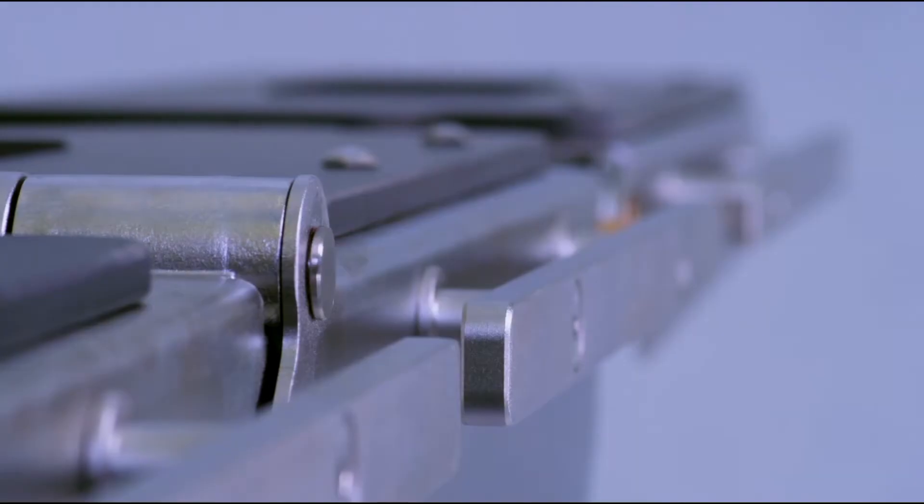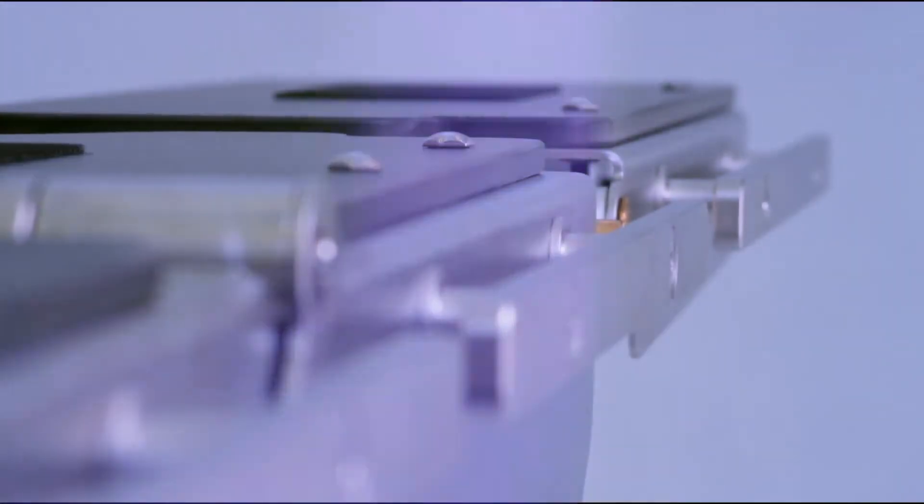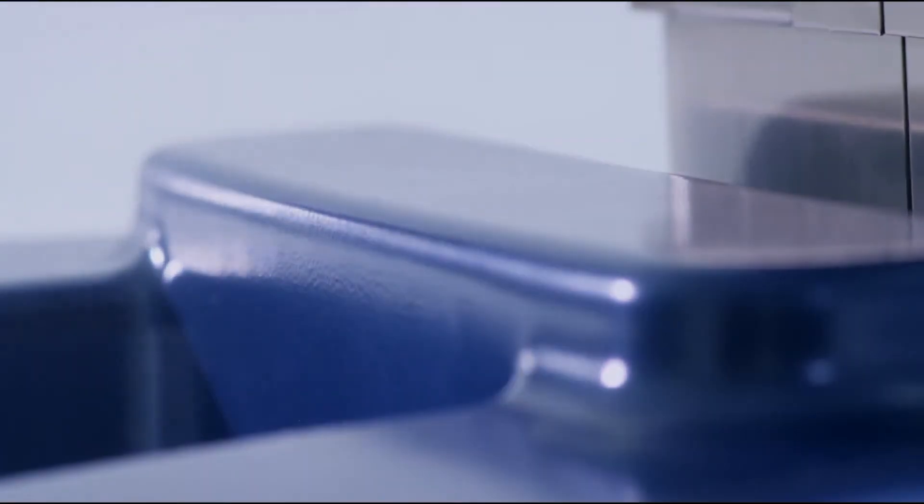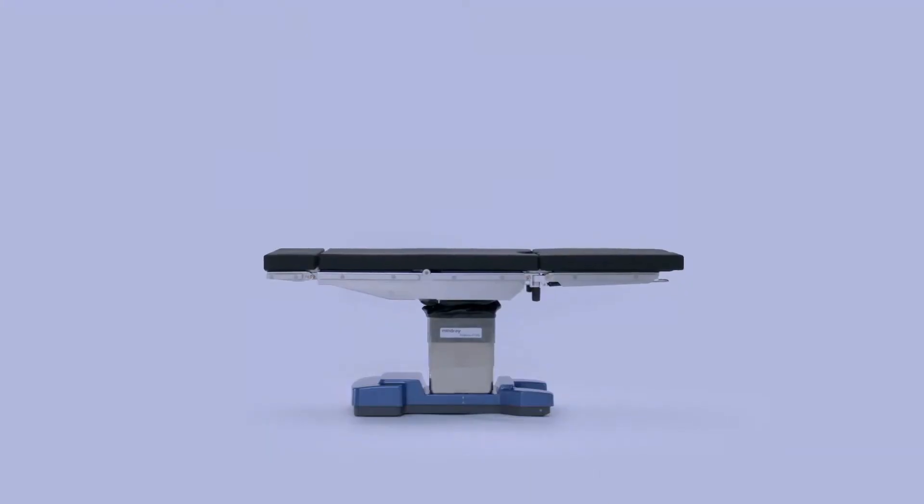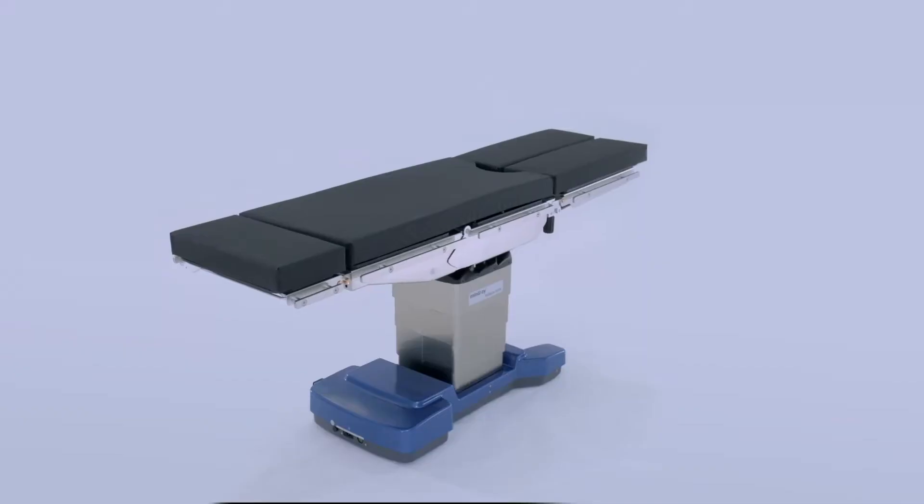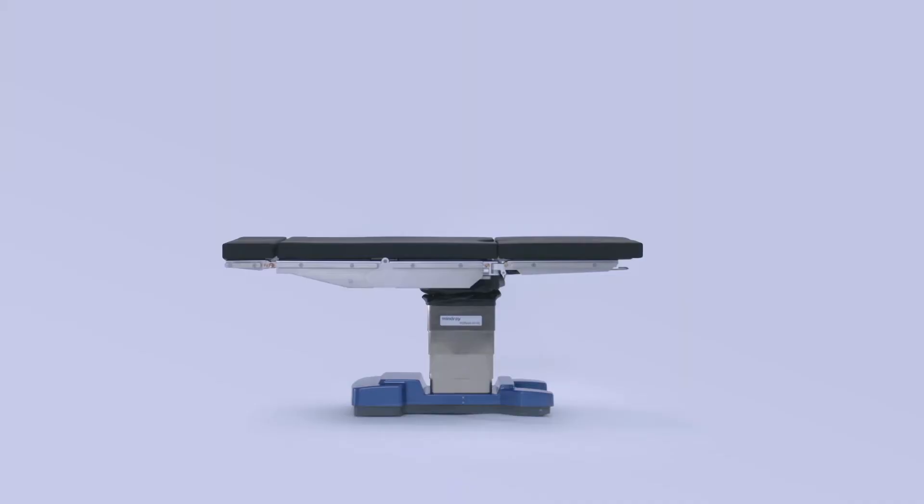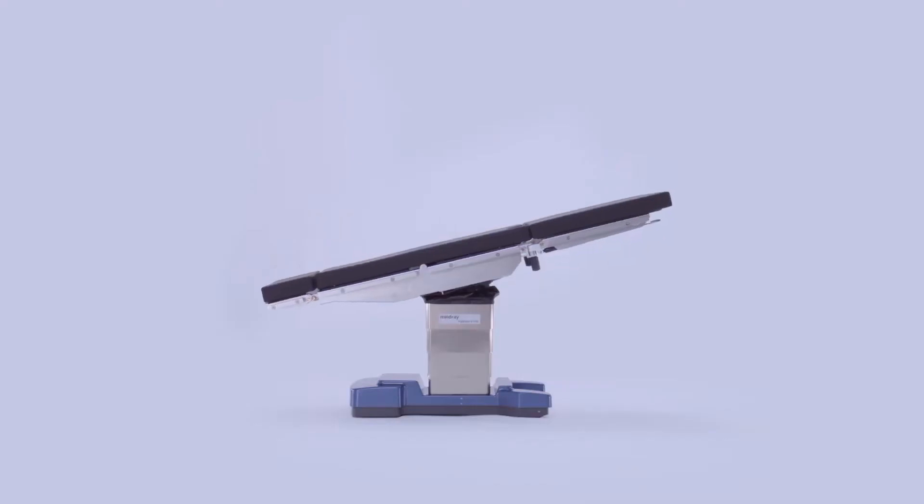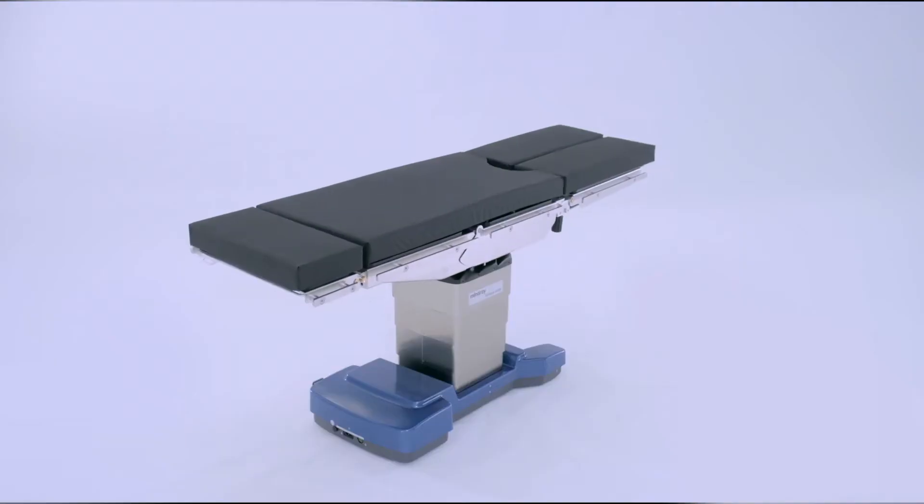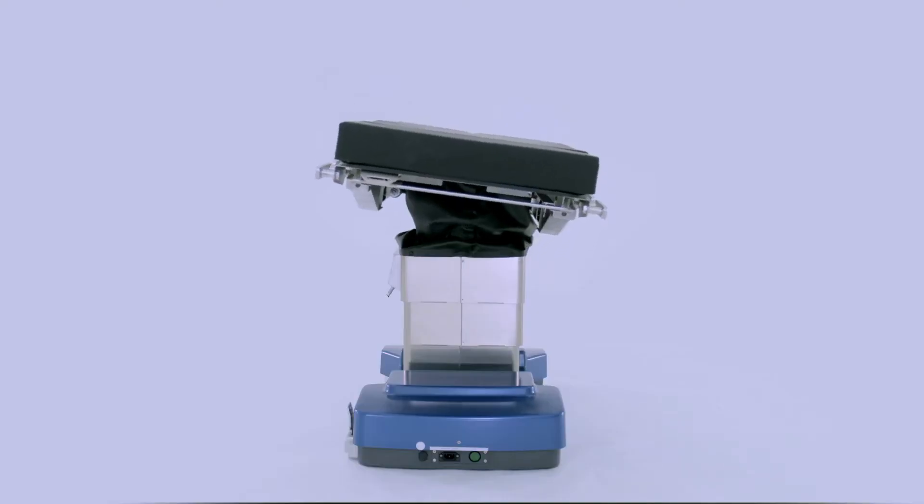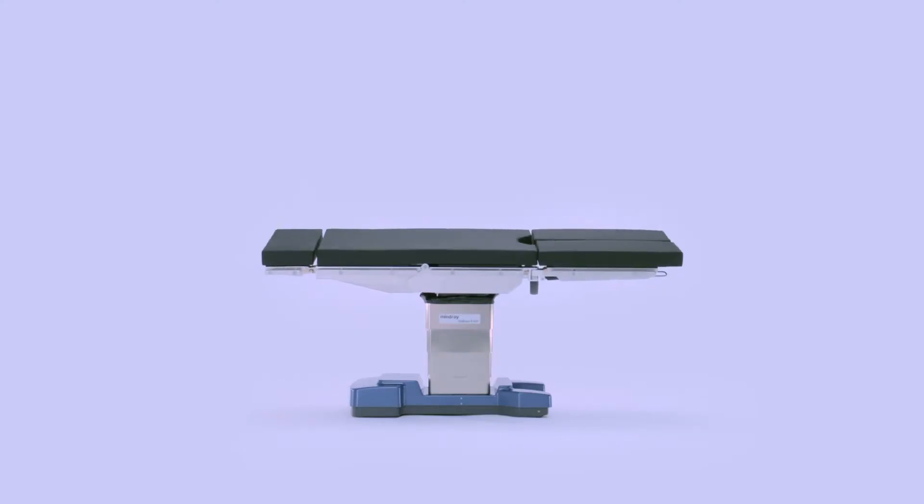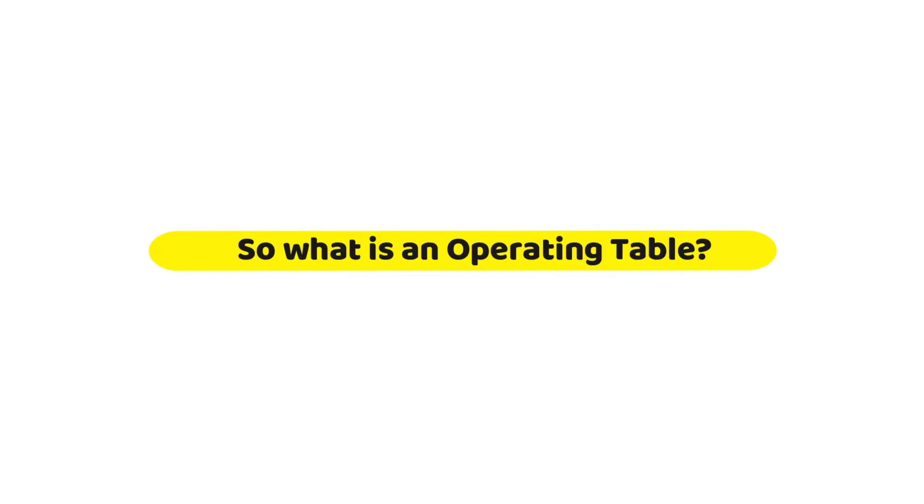Hey everyone, welcome back to Biomedical Engineers TV. Today we're diving into an essential but often overlooked part of medical procedures: operation theater beds. Whether you've seen them in a hospital or are just curious, these beds play a key role in surgical operations. But did you know there are different types of operation theater beds?